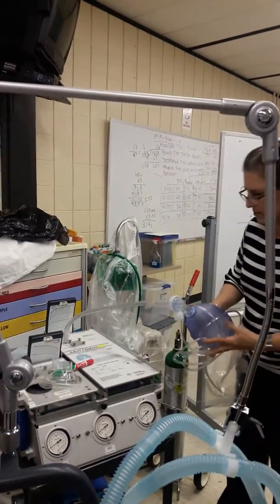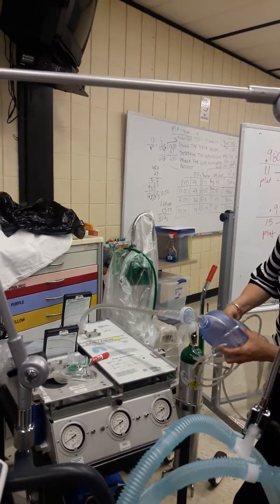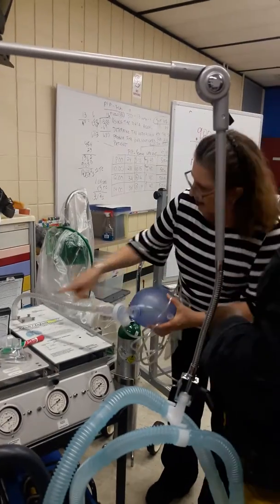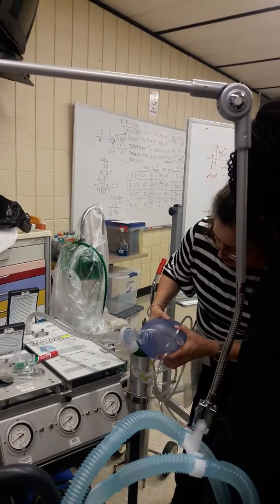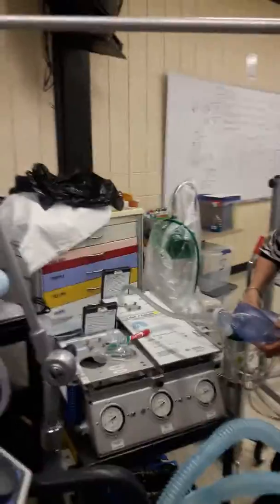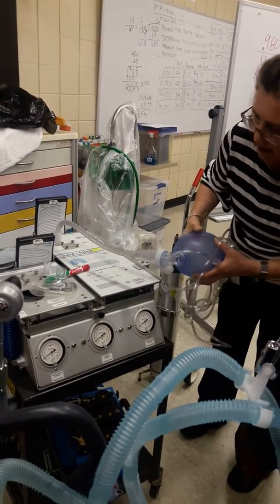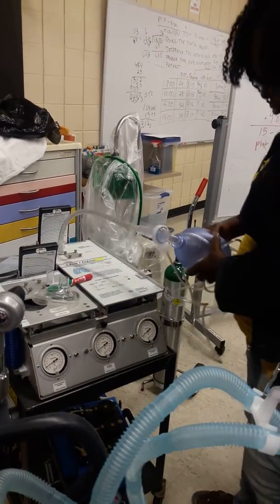So what I want you to do is just go up to 500. Feel what it's like with normal compliance of 0.1 liters, or 100 milliliters per centimeter of water, and look at the pressure that it's taking to go there. It's low, right? Very little pressure. If I do a plateau here, see my plateau? My plateau is 5. So I can model it here. I can't do it on the vent because it's missing.